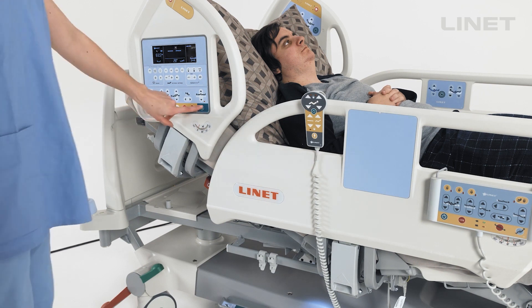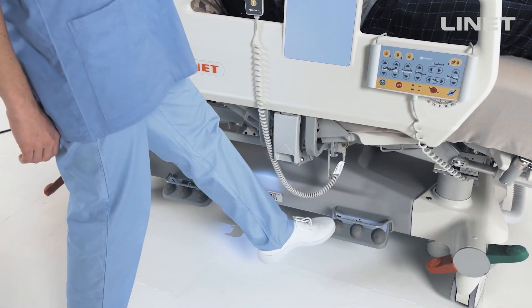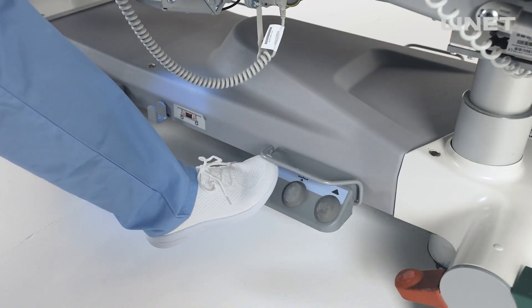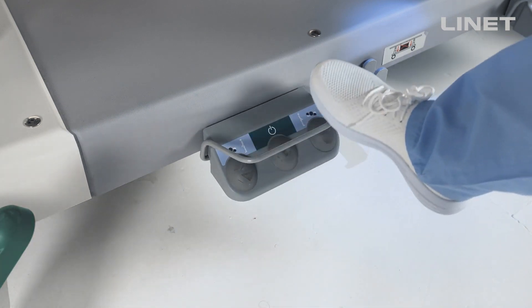To activate foot pedals, press any green go button or push the pedal twice. There is always a bar over the controls to prevent unintentional movement.